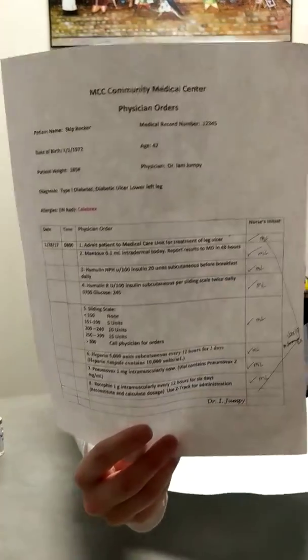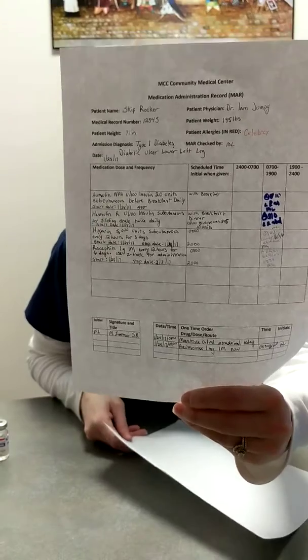Alright, so we are doing an intradermal TB demonstration for our patient Skip. And here's our orders, and then our MAR, and we wrote this order into the one time because that's what it is. And we're going to remember during this whole process to maintain the 6 rights of medication administration, so right medication, right route, right patient, right dose, right time, and right documentation.